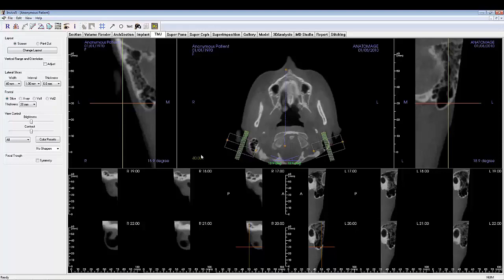You'll learn how to create a focal trough over a patient's condyle, allowing for both a multi-slice and a 3D rendered visualization.